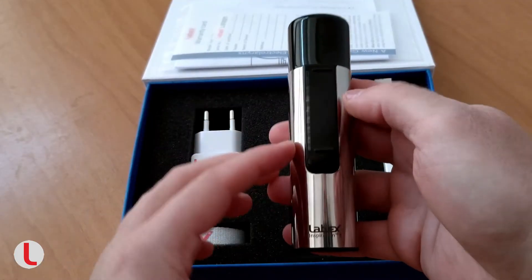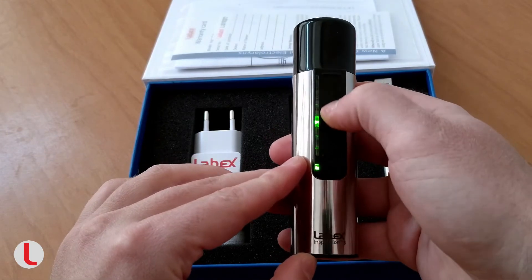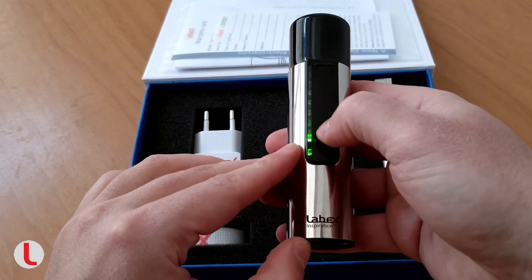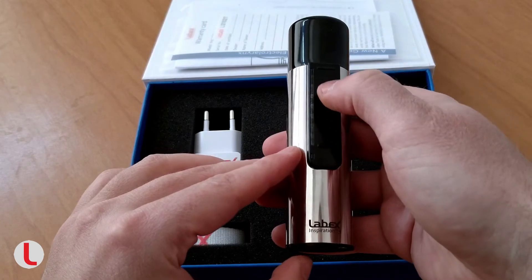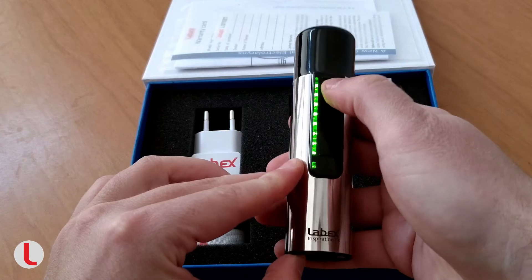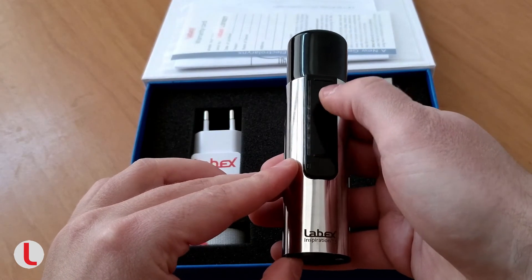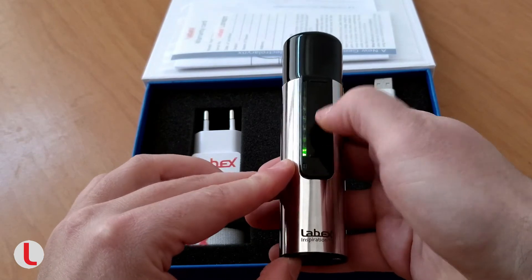Quickly raise or lower the volume level. To do so, touch the panel then hold the settings button. Sliding to the top will raise the volume. Sliding down will lower the volume.